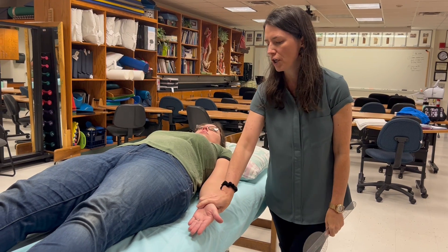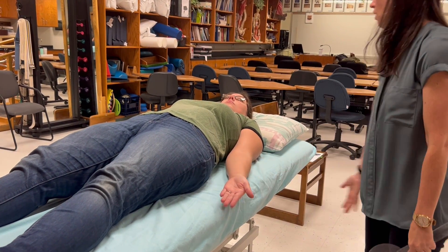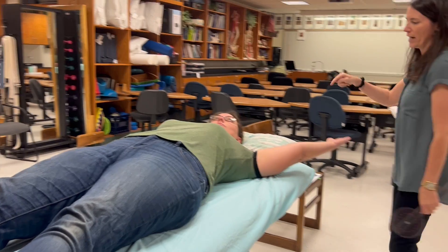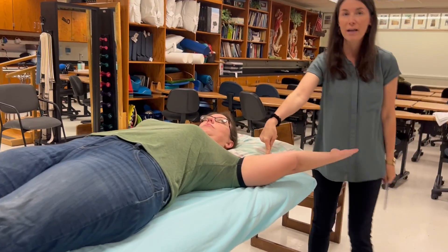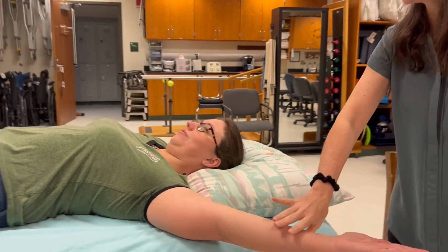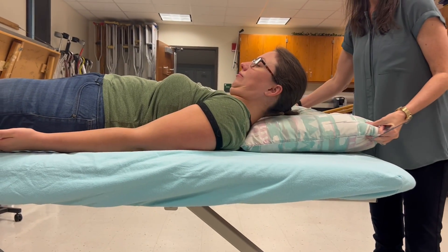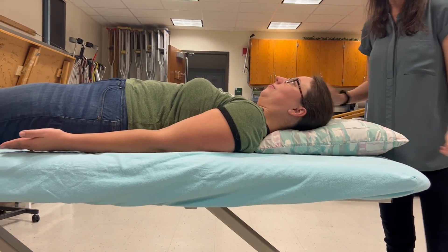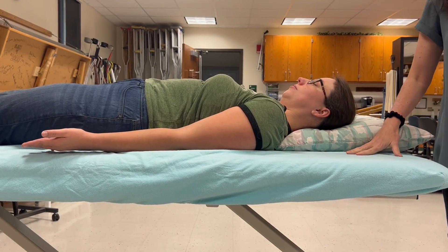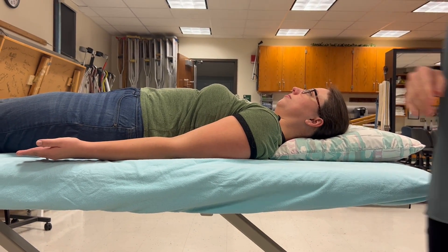So we're going to say, turn your palm up to the ceiling and I'm going to have you slide this arm out towards your side, up towards your ear, kind of like you're making a snow angel. You'll notice the pillow's in the way, so that's not allowed — bring your arm back down. If you're using a pillow, that's fine, just move it over so her head is still supported but the pillow's not going to impede her range of motion.